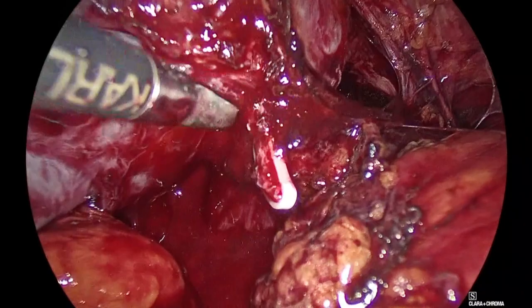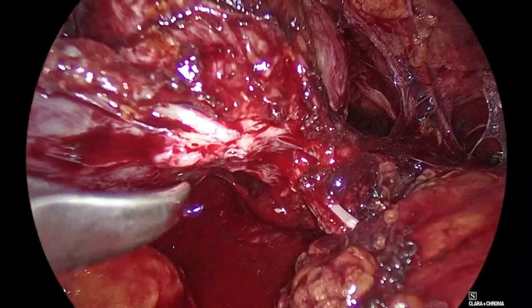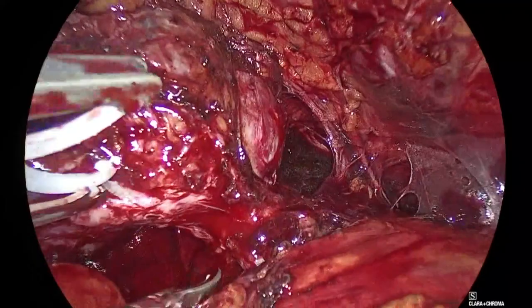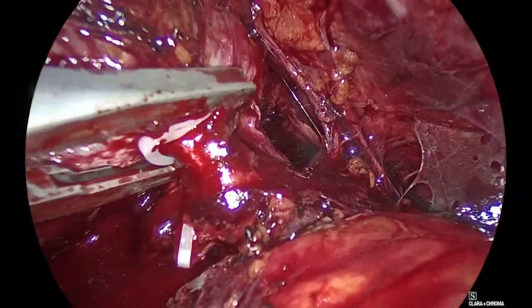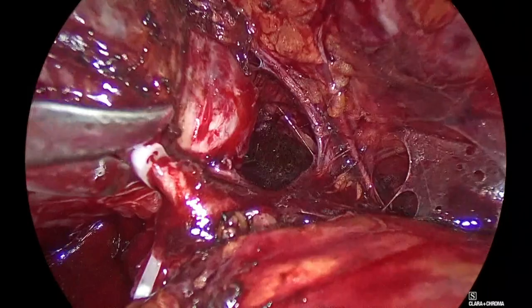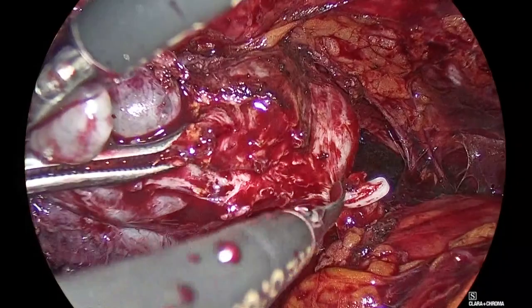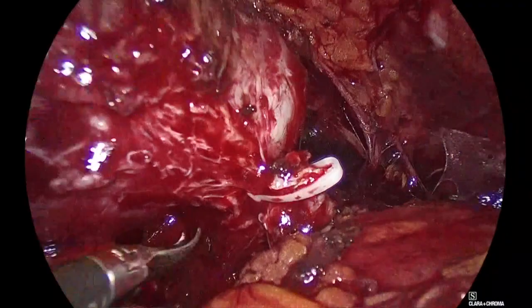Clip. See, again, every time I cut something, I go further in, laterally, like this. This is the move. Good. Come in. Show me down here, brother. Good. There you go. Perfect. Strong grasper. Come in. Show me. Good. Every time I cut, I'm pulling the prostate out, eh? You notice that, look, show me, go back, Padeli. Look, I cut and I pull the prostate out. So it serves me, it comes on me. Come, show me. Aspirate, go back. Aspirate, Panagiotis. Good. Come in.